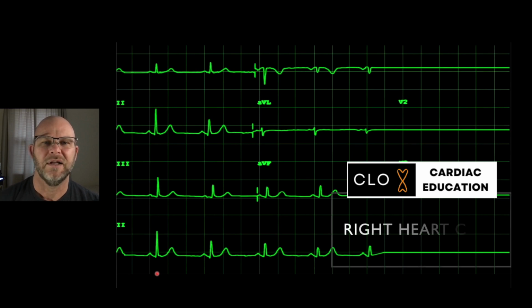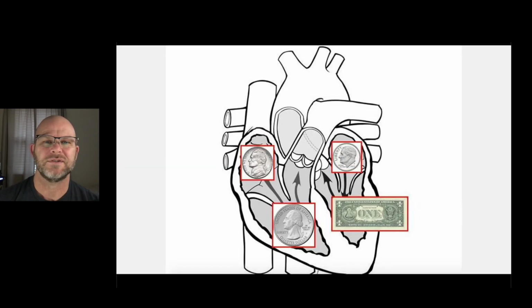My name's Scott. Today we're going to talk about right heart caths. Right heart caths are a completely venous procedure. We talked about left and right heart caths in a previous video. Today we're going to focus more on the right heart cath aspect.